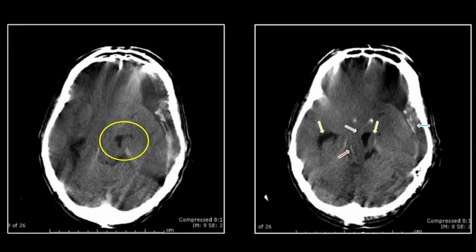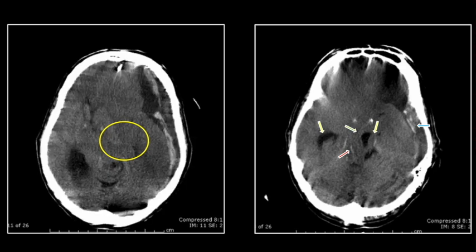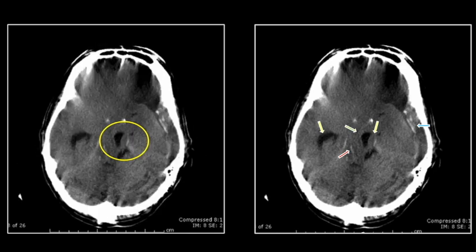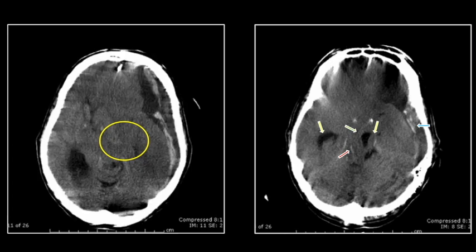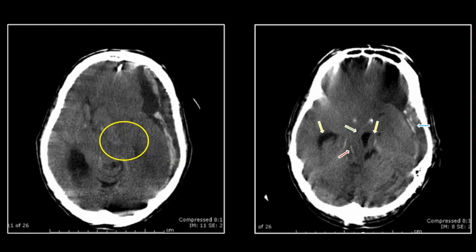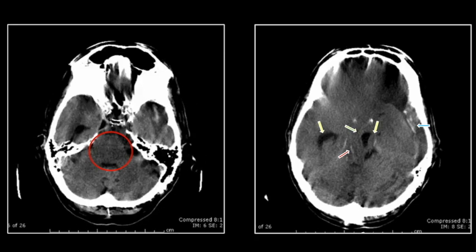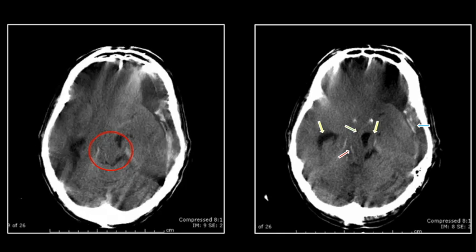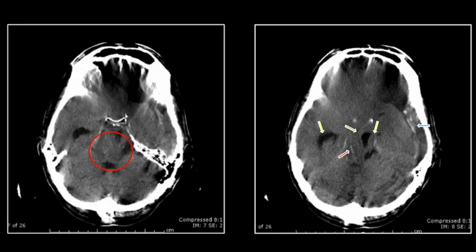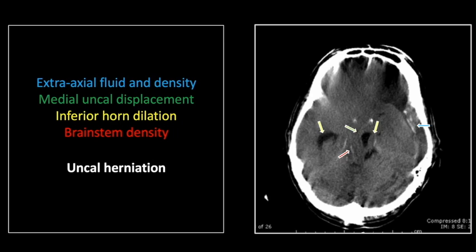Let's look first at the uncal herniation and trapped horn — note that pinched, narrowed portion of the inferior horn and dilation just at its tip within the herniated portion of the uncus. Then, let's look at the hypodense brainstem with its central Duret hemorrhage. That is a case of subdural hemorrhage with associated uncal herniation, trapped horn, and Duret hemorrhage of the brainstem.